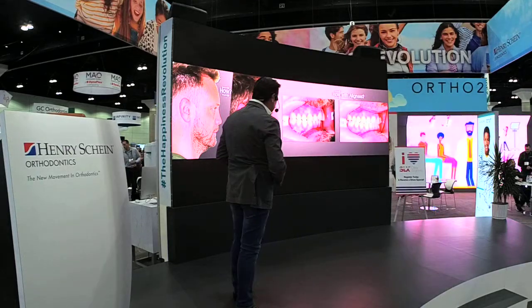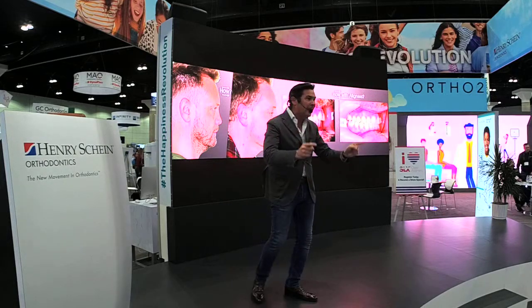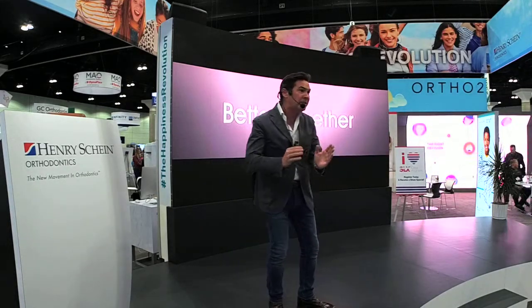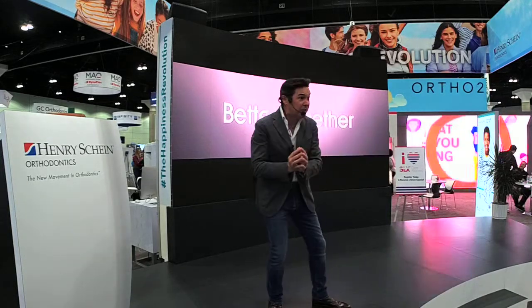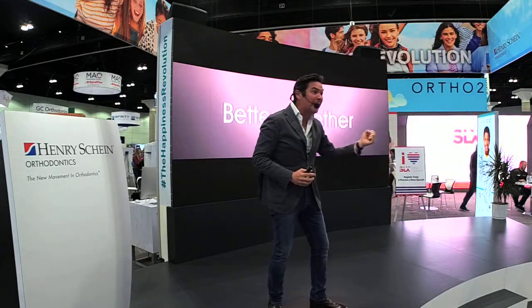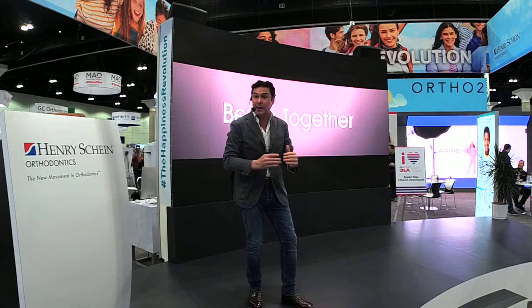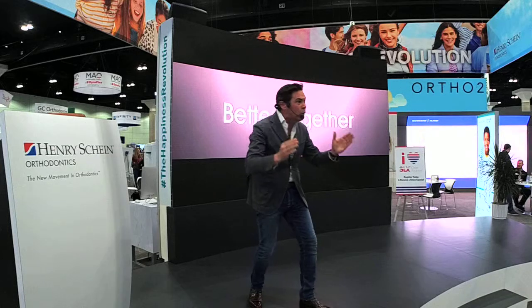better do it. So how can we go with aligners from this scenario into this in a short period of time, efficiently and with predictability? We understand that aligners are not efficient in the sagittal relation. So if we have a technology that is great, but it's not efficient, what do we do? We take what is efficient. The Motion appliance is efficient in class 2, so we use the Motion appliance, we convert the case into class 1, and once we have the case in class 1, everything will be easier to accomplish with aligners in a short period.